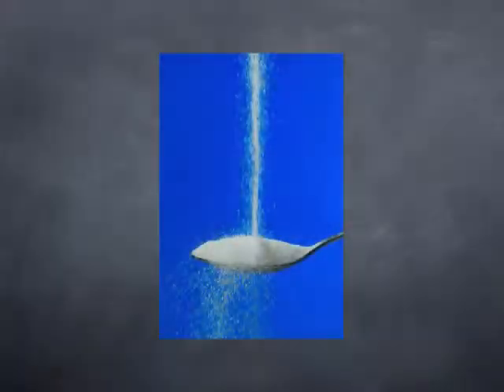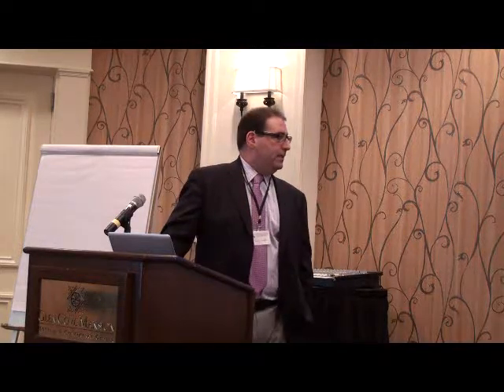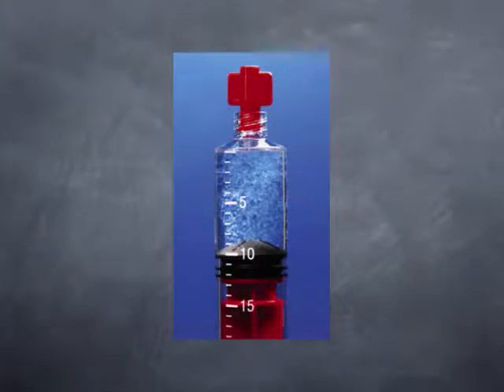So everyone knows what that is. That's just table sugar, but it doesn't look that dissimilar from some of the particles that we inject into the blood vessels to block up the blood supply to these tumors. And this is one of the agents that we use.